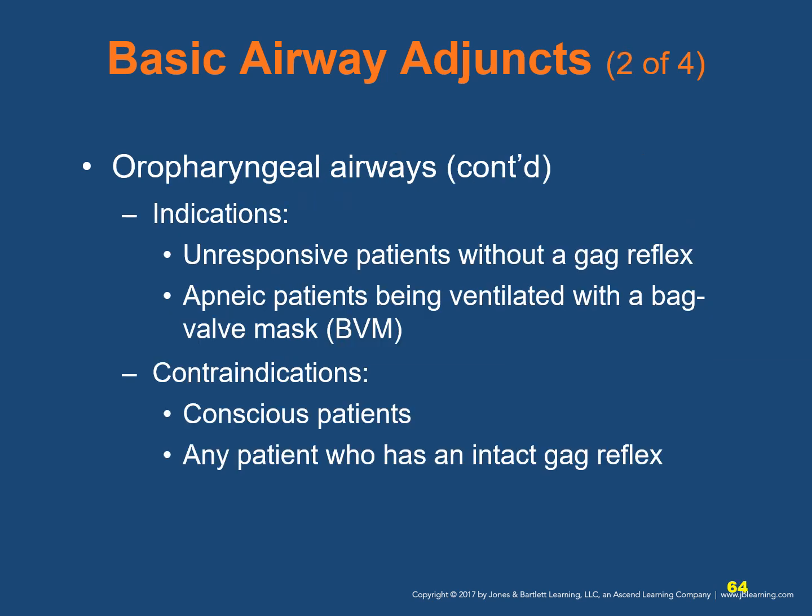Indications for use of an oropharyngeal airway are unresponsive patients without a gag reflex who are breathing, or apneic patients who are being ventilated with a BVM. Contraindications are patients who are conscious, or any patient, conscious or unconscious, who has an intact gag reflex.